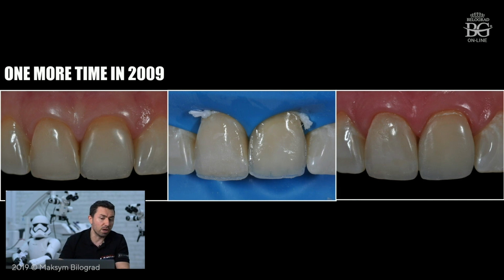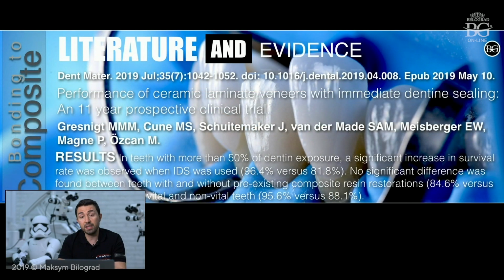We failed on color. So this is a learning curve, you see. Everybody learns from mistakes, and I'm not an exception. So we made some adjustments and redesign, and finally we ended up with porcelain veneers, and one of these porcelain veneers was bonded to a really big portion of composite.